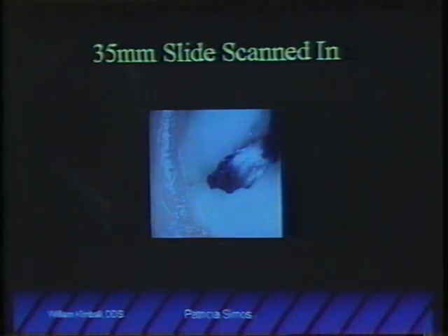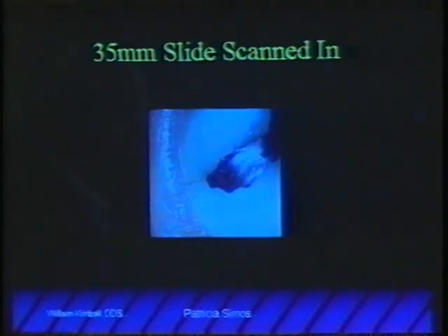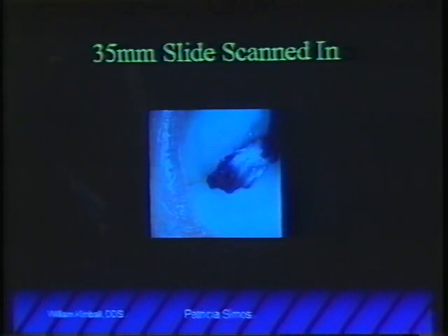This image was an actual 35mm slide that was scanned in using a 35mm slide scanner and stored in a digital format in the computer. This means that you can now store your entire library of 35mm slides, or if you obtain slides elsewhere, you can scan them in and use them in your own presentations.